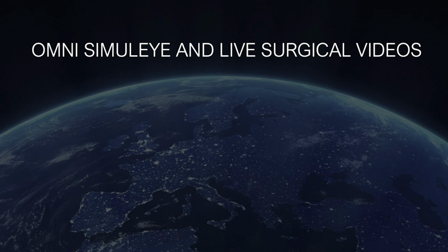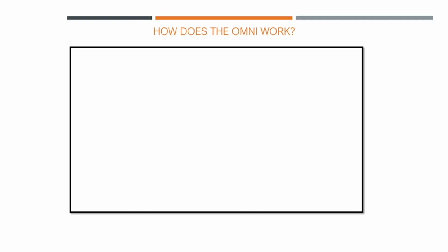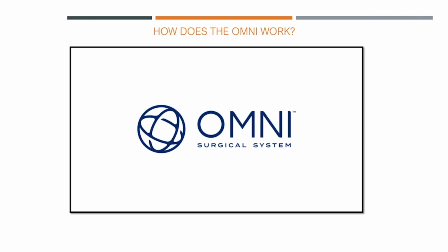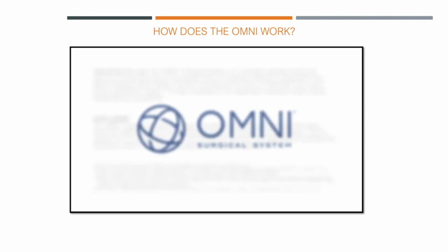And now I'd like to get into some of the videos. We're going to see several videos ahead, one of which is an animation that shows how the Omni surgical system works. I'd like to thank Sight Sciences for providing this surgical system animation video.